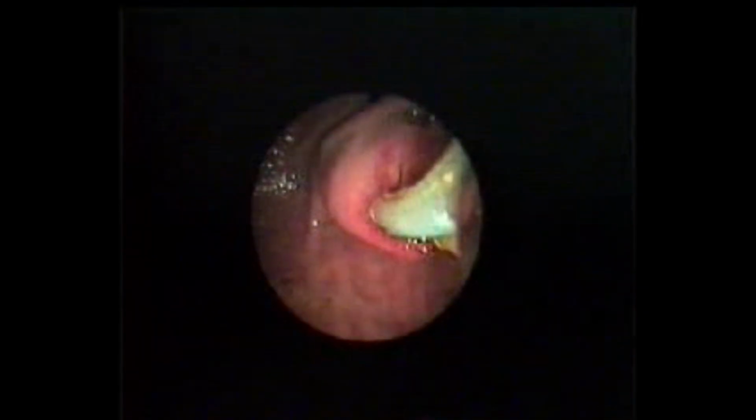An endoscopic basket was introduced through the ampullary orifice into the bile duct. The worm was caught with the basket and removed from the bile duct. The 25 cm long and 6 mm thick worm extracted from the bile duct is shown.